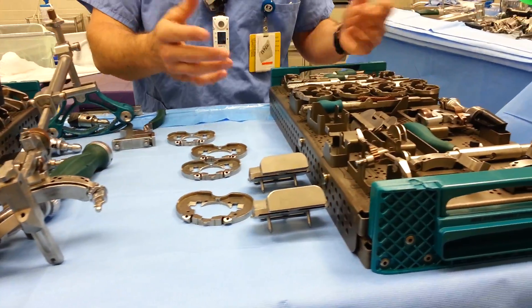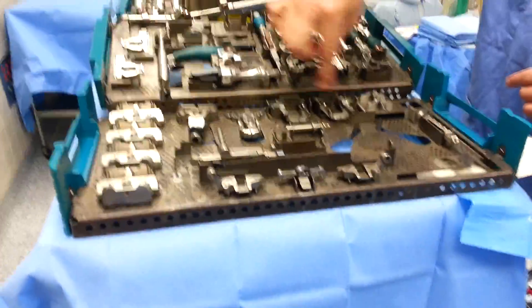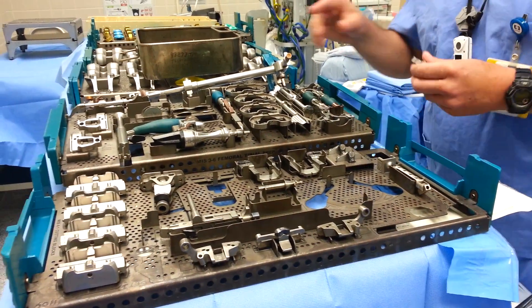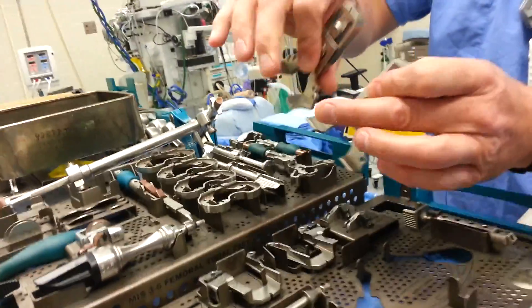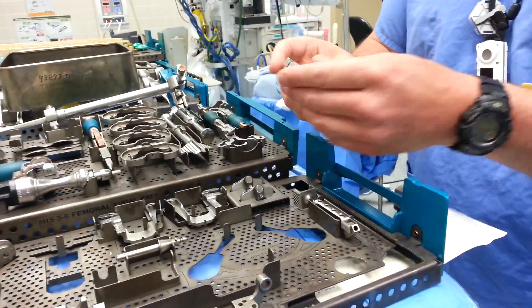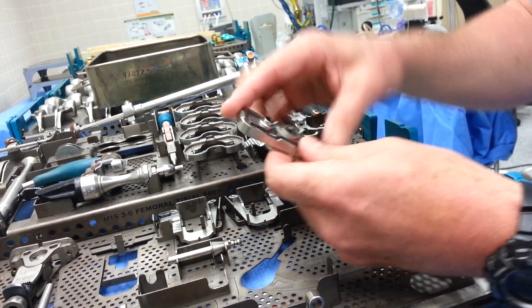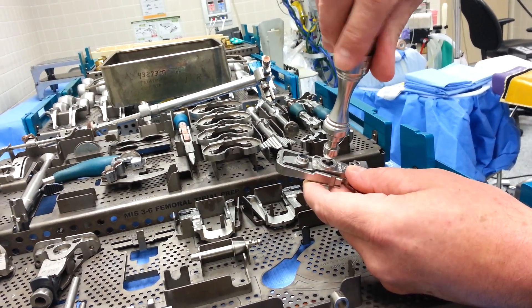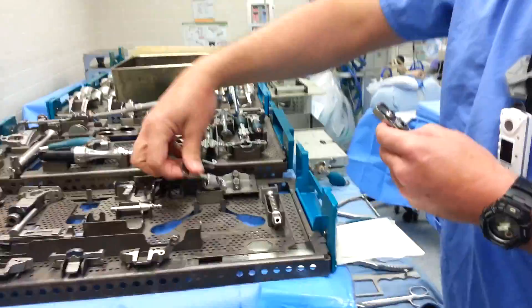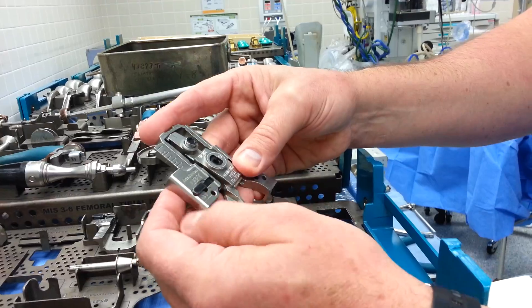We always start on the femoral side. To get to the cutting block we need to set up a guide — we need to know what size to cut. There's a right and a left block; this goes underneath your femoral condyles. You can use short or long feet depending on surgeon preference. We'll work with the short-footed one for a left knee. Push this button and set it up for three degrees left, which is what the physicians here prefer. Always make sure this little dial is on zero to start. Then grab the left block — it says left on it — flip up the little tab, slide them together, and flip that shut. It's done and ready to go.